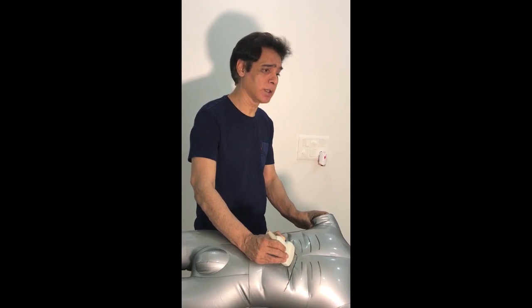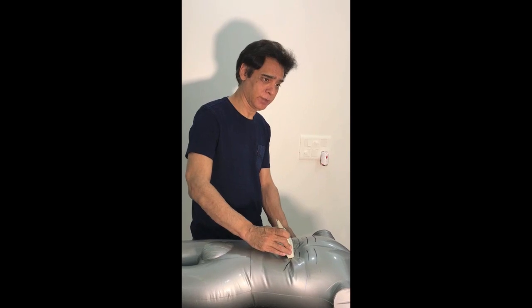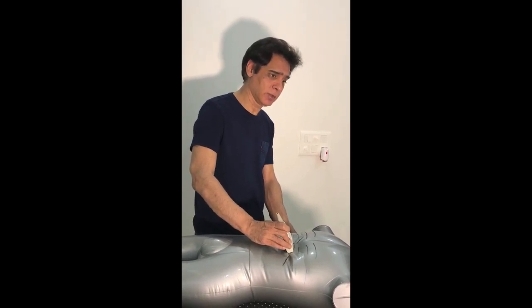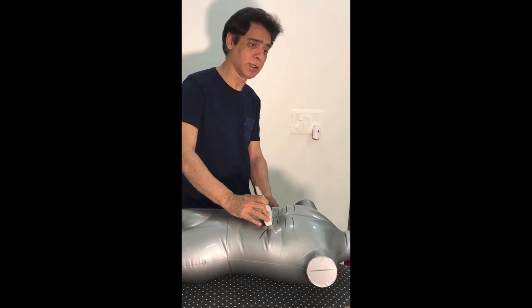Now you should be able to see the CBD within the head of the pancreas. For this, what you can do is, get the patient supine again, and put the probe transversely here, with a little bit of rotation here and there, try to get the porto-splenic confluence complex, and there you can see the IVC, the aorta next to it, and just above the IVC, within the lower part of the head of the pancreas, you can see a small circular dot that is the terminal part of CBD.